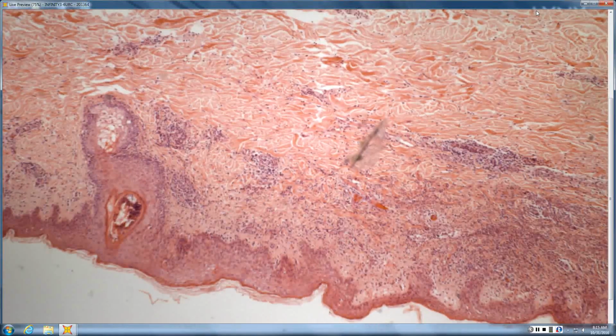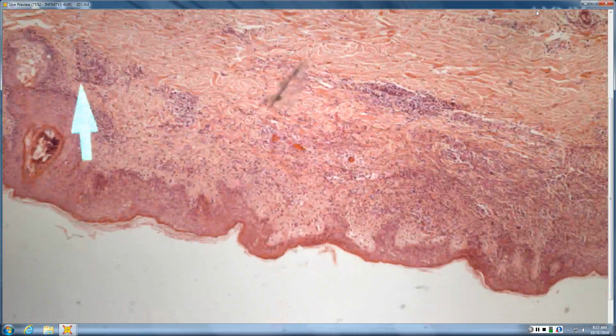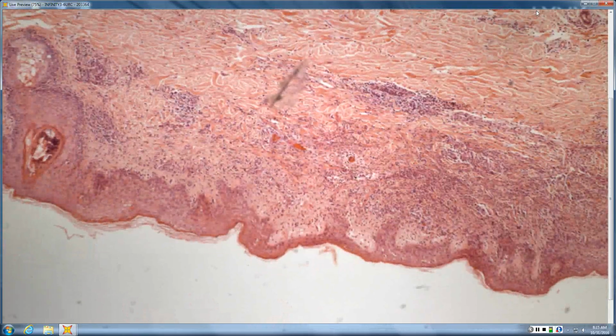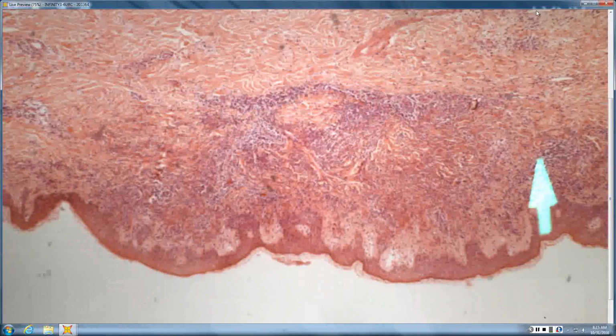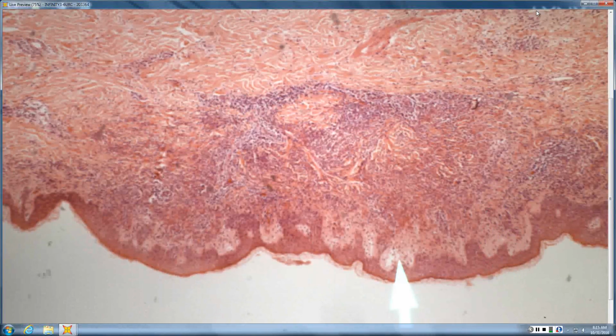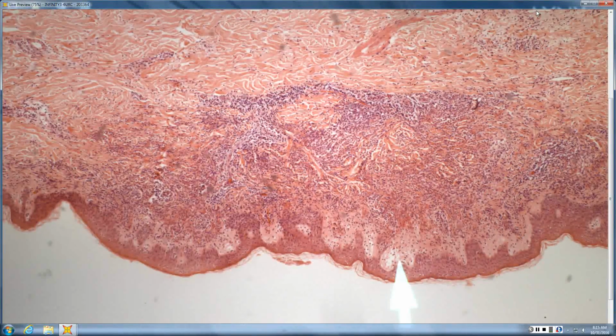Now there is a suppurative folliculitis there, so it brings up the possibility of tinea and all kinds of other things. But if that suppurative folliculitis is a red herring, and I have nodular and diffuse neutrophils, and I have pretty marked papillary dermal edema, what pattern am I in? Like a neutrophilic dermatosis.